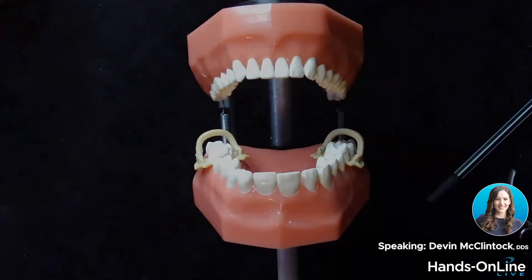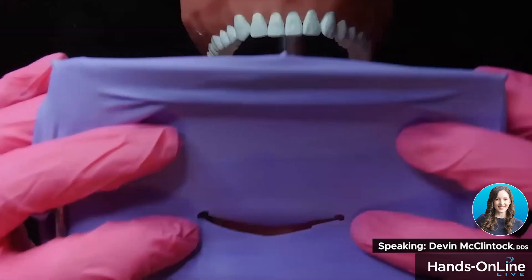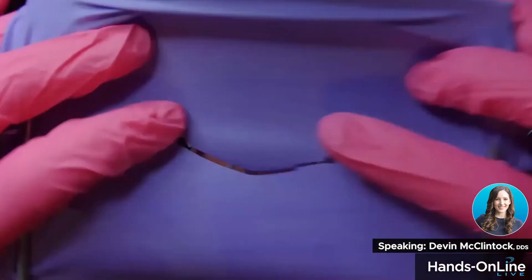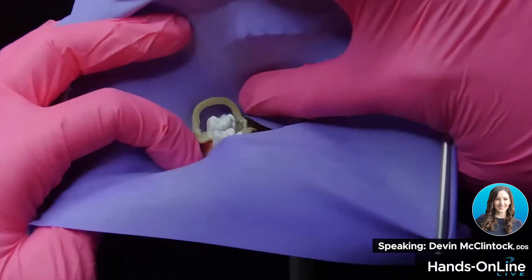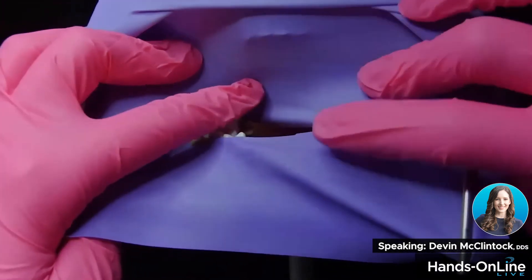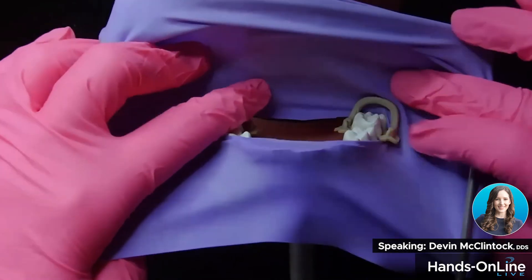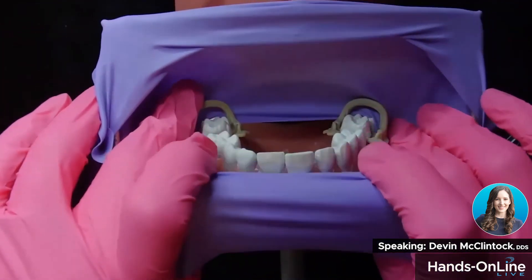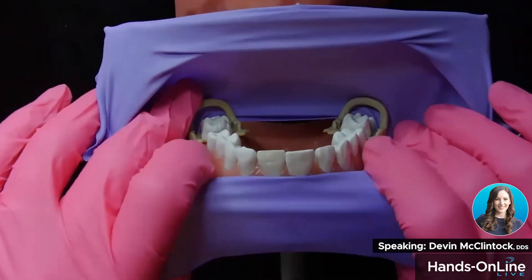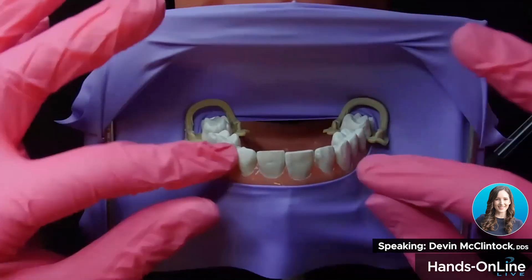When you come in with your dam, I recommend going around one clamp and then the other. You come in around the outside of this clamp, and then around the outside of the other clamp — otherwise it starts to bind a little bit. It's easier on the patient than on the typodont because the typodont doesn't have a lip. Basically, you just tuck this up and under the lip.